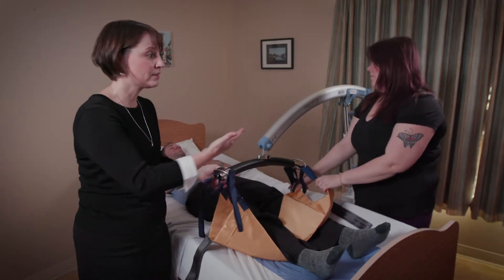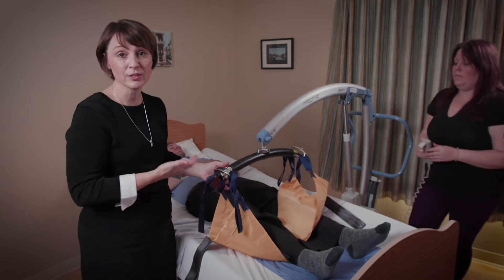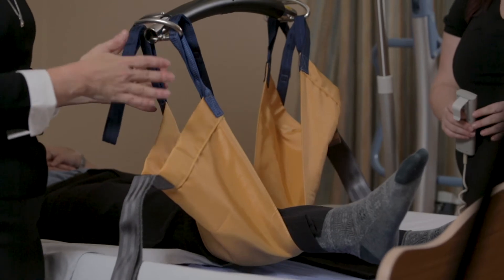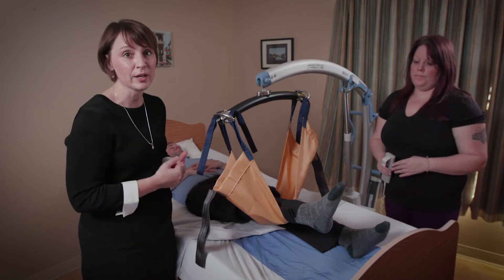That appropriate height is going to depend on the height of the caregiver and how high you may need to move it so that you're comfortable and have a comfortable posture and position. But also it's going to depend on the kind of care that you're providing at the time — perhaps it's particular wound care that you're delivering.